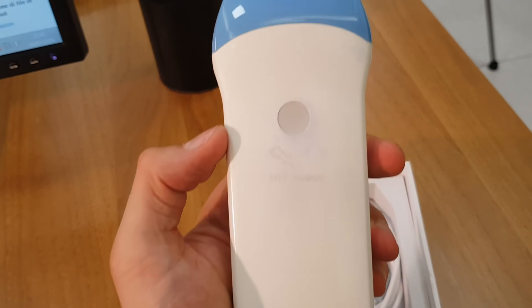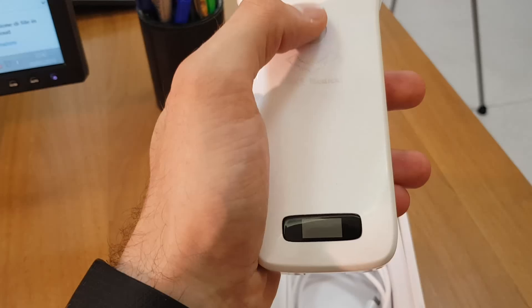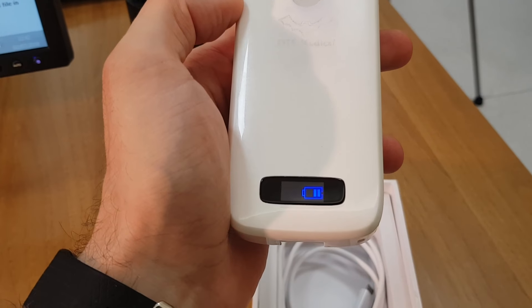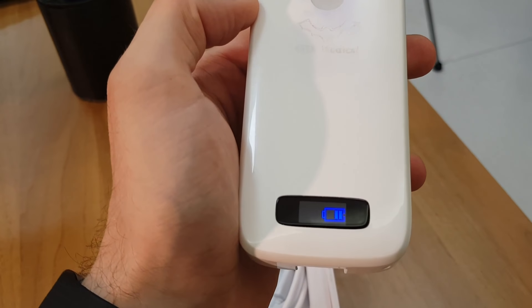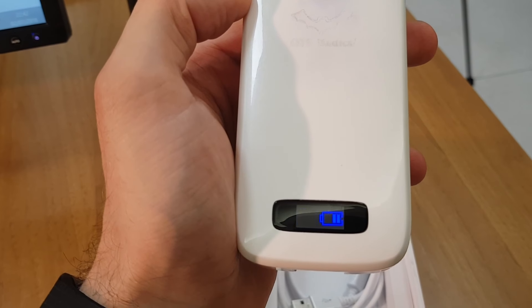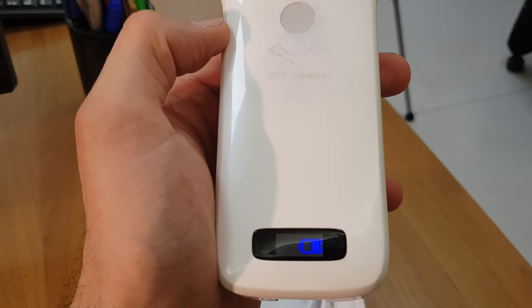On the back we have the button that serves both for powering on and for the freeze. Below there is a battery charge indicator, plus an indicator that tells us if the device is connected to the Wi-Fi of the phone, which will be used as the screen. If it is blinking, it means it is searching but not finding a connection because it is currently not connected to any device.